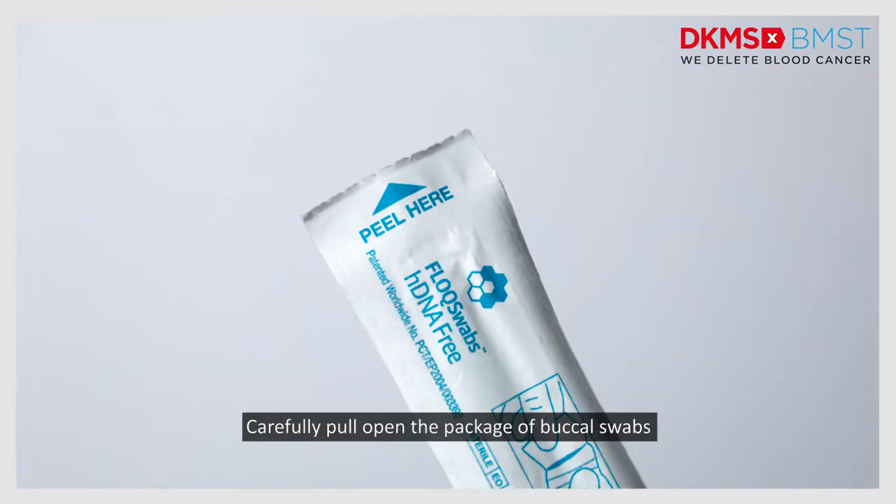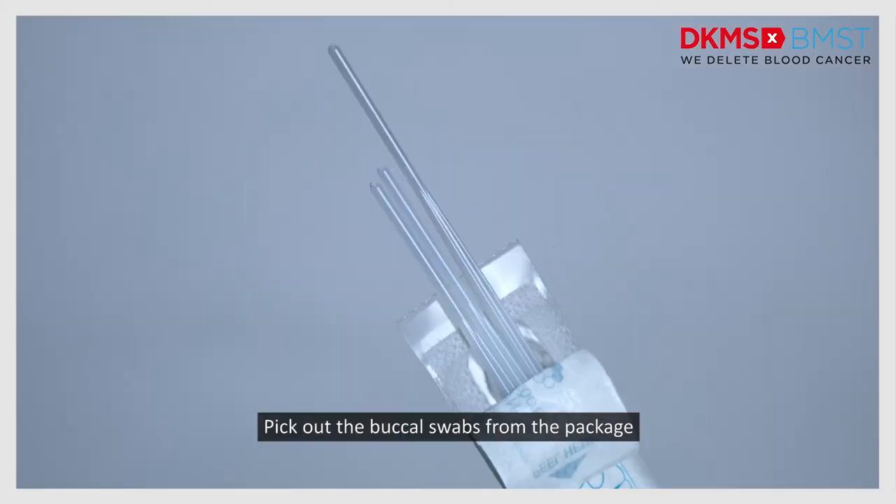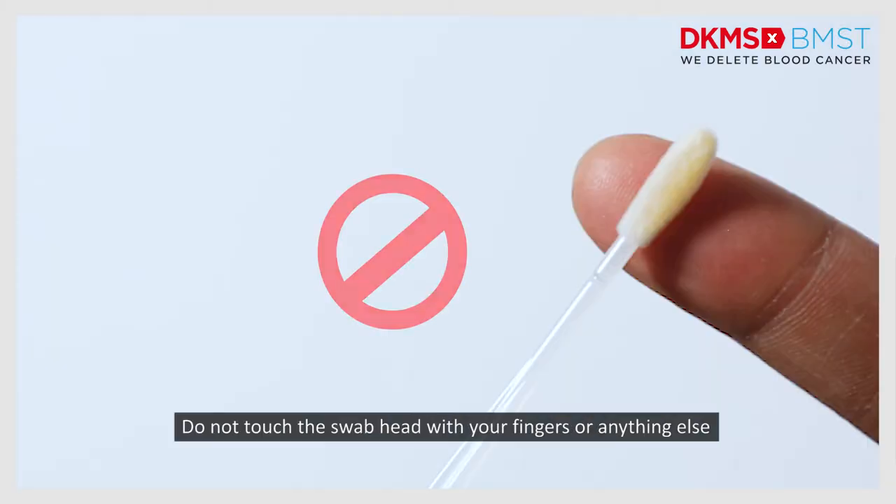Carefully pull open the package of buccal swabs. Pick out the buccal swabs from the package. Do not touch the swab head with your fingers or anything else.